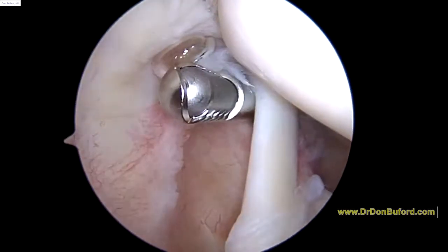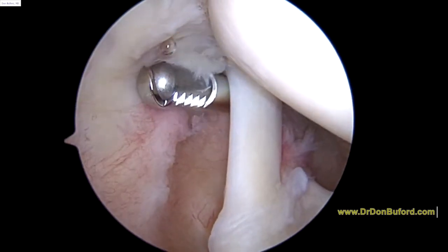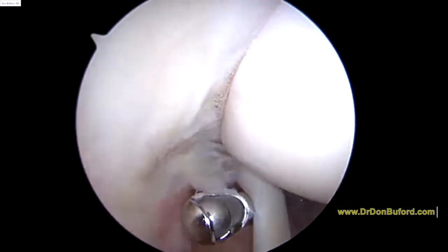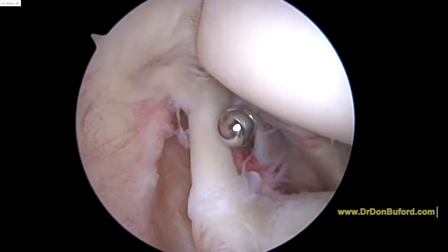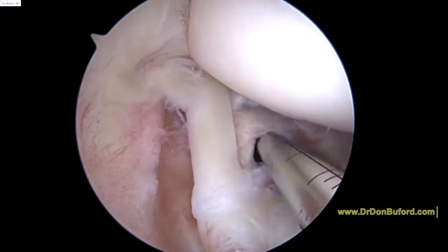Now I'm just going to test it and see how much it comes back. We're going to look up here next at the rotator cuff, and the cuff looks intact in terms of tearing.